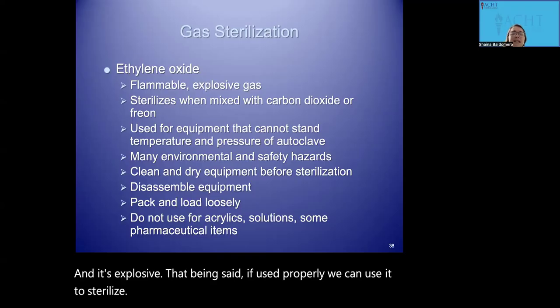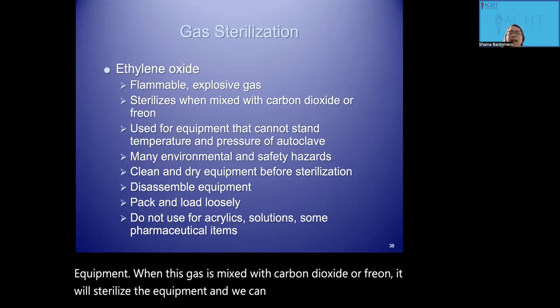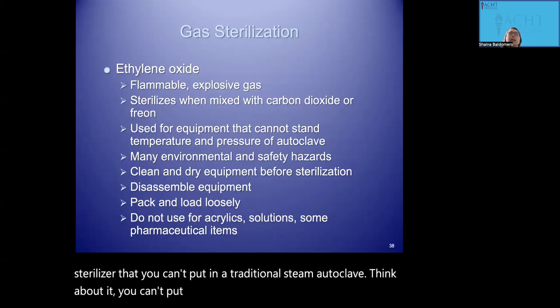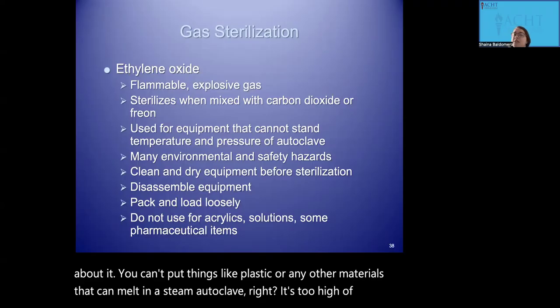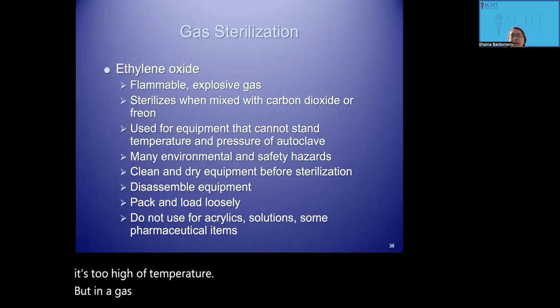When this gas is mixed with carbon dioxide or freon, it will sterilize the equipment. And we can put equipment in a gas sterilizer that you can't put in a traditional steam autoclave. Think about it. You can't put things like plastic or any other materials that can melt in a steam autoclave, right? It's too high of pressure, it's too high of temperature. But in a gas sterilizer, it doesn't use heat or pressure, it just uses the release of gas.